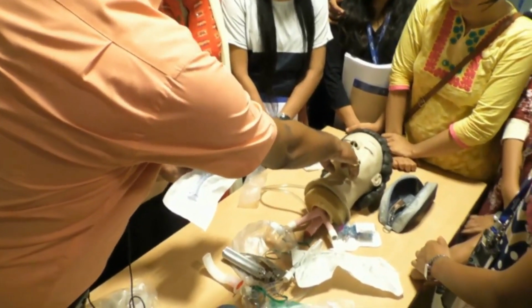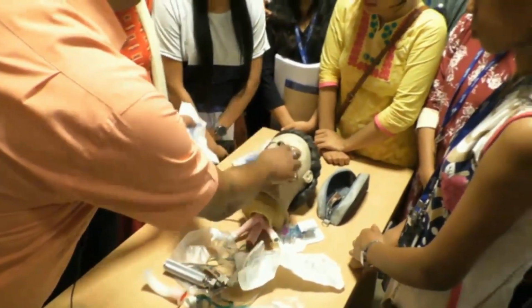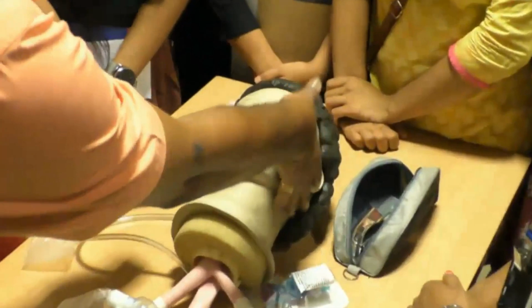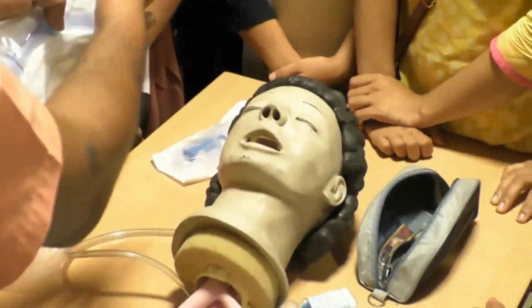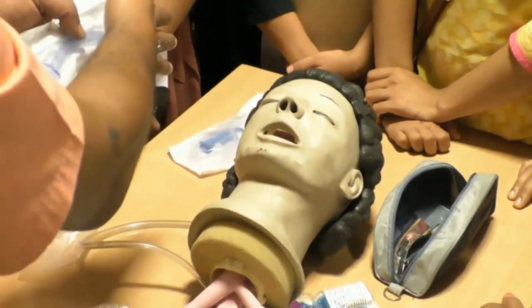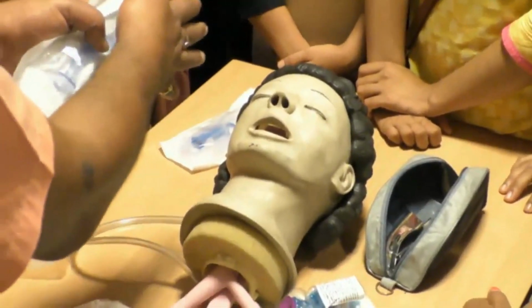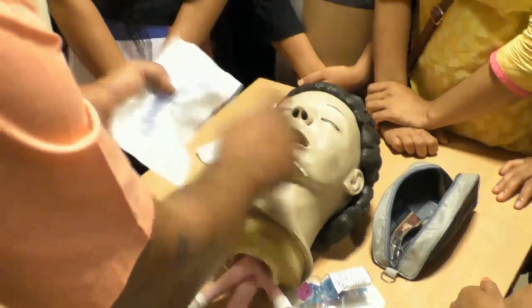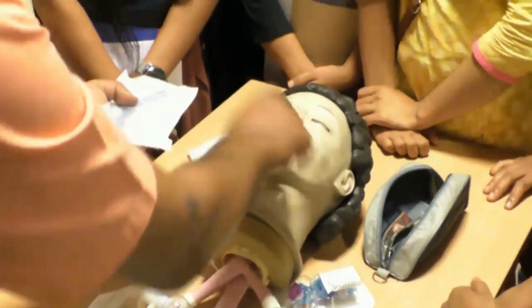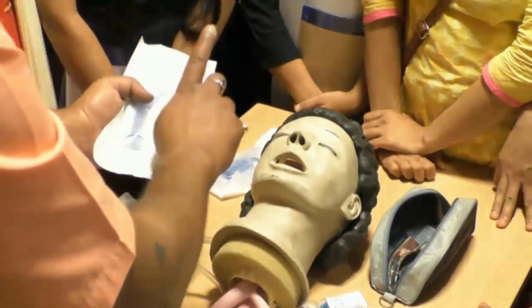right nostril. We have to go through the right nostril, because if we put it in the left nose, what will happen? The pharyngeal wall is there. If we go through the left nose, this will start touching the pharyngeal wall. So what will happen? This opening will be occluded. So the patient will have some breathing difficulty at that time. So whenever we insert it, we have to insert it to the right. So the slit should be facing medially. That is the aim. ठीक है ना?